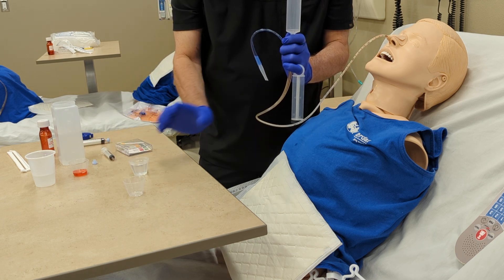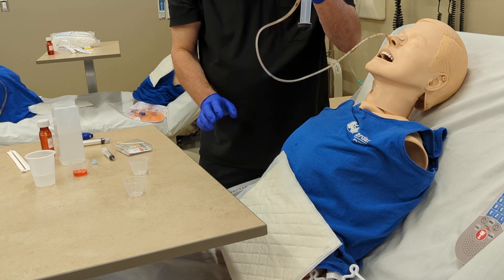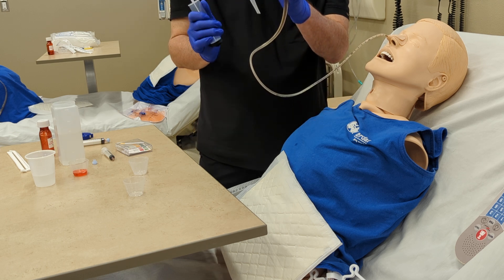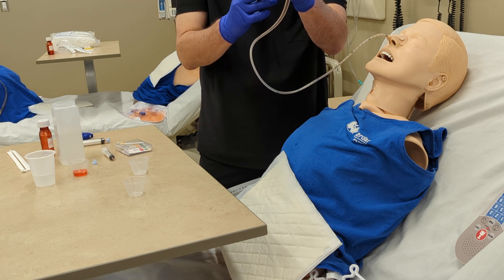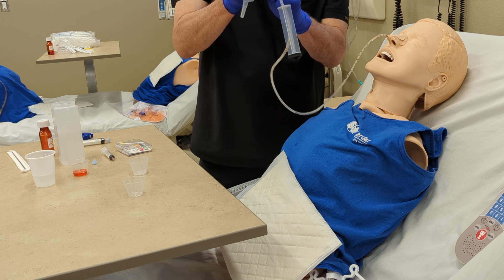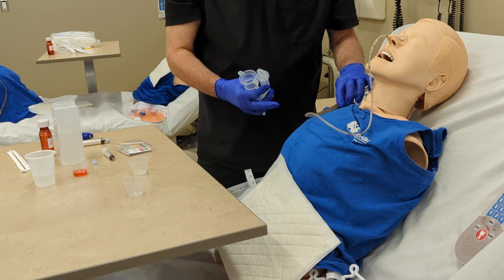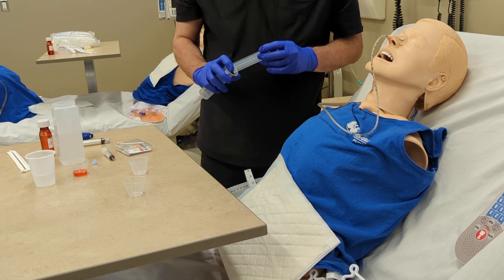I can control it by lowering it if it's going too fast. Then I'm going to top it off with my flush of 30 cc's of water. It's slowing down a little, so I'm going to give it a little boost — and now it's flowing. I'm going to let all the fluid go through. Now we're good to go. I'm going to cap it, position the patient in a comfortable spot, and if we have a safety pin, we can pin this to his gown. Low position. And that's NG administration. Thank you.